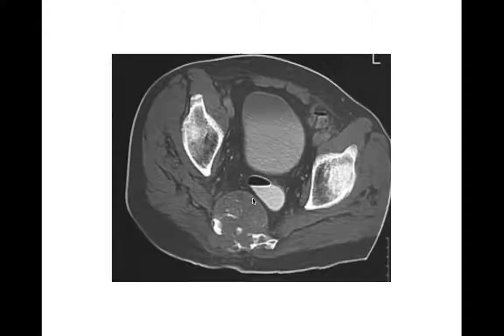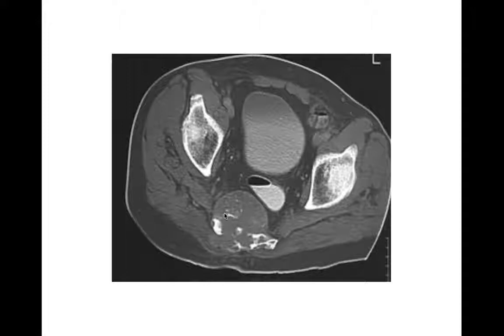Here's a radiograph showing some density overlying the sacrum — you can't quite see the arcuate lines, and there's some question about the matrix. On advanced imaging, we see the lesion in the sacrum with a soft tissue component, it's expansile, and has some internal matrix. This one turned out to be a chordoma. Remember, chordomas tend to occur along the midline from clivus to sacrum — they can occur in vertebral bodies too, but the sacrum is a favorite spot.